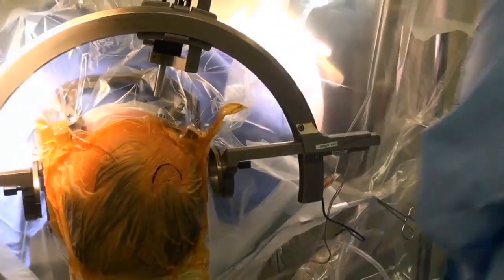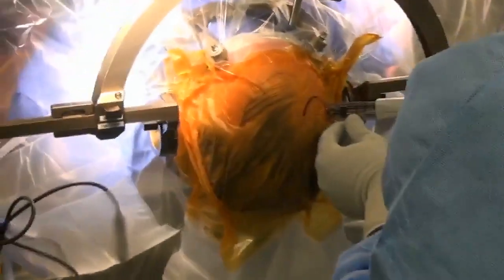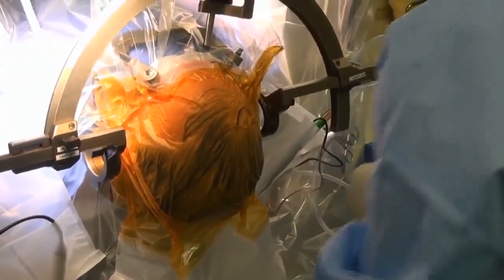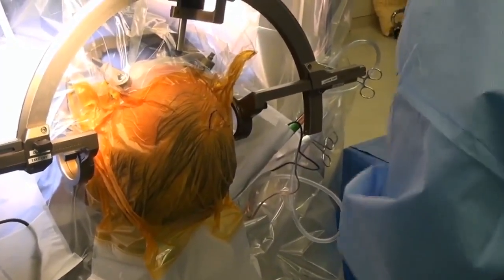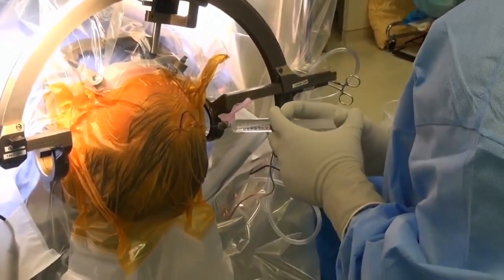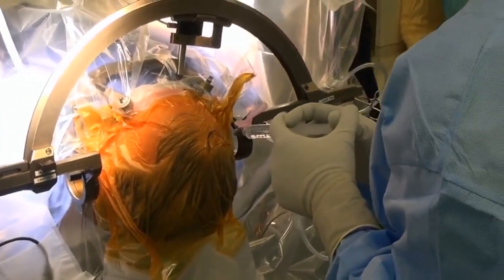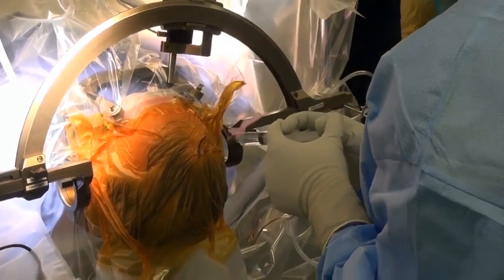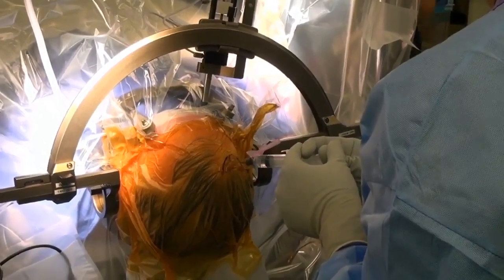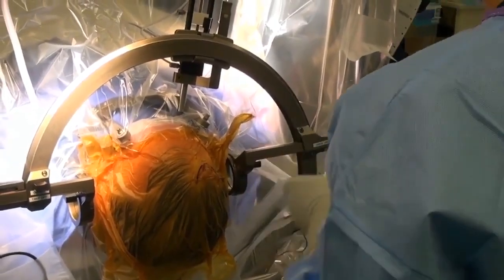Okay. Stapler. Okay. And local, and then for our pause, we got to watch patient privacy. All right. Okay, great. Yeah, let's go ahead and mute it. We're about ready for that.